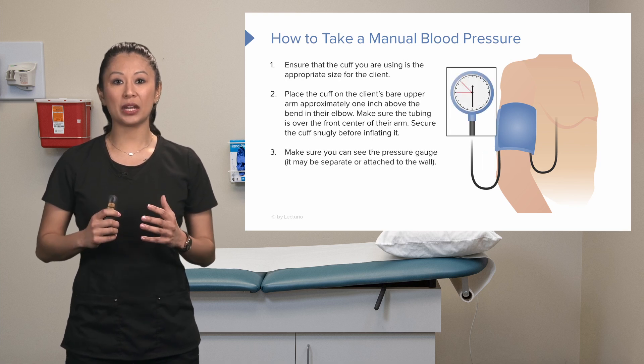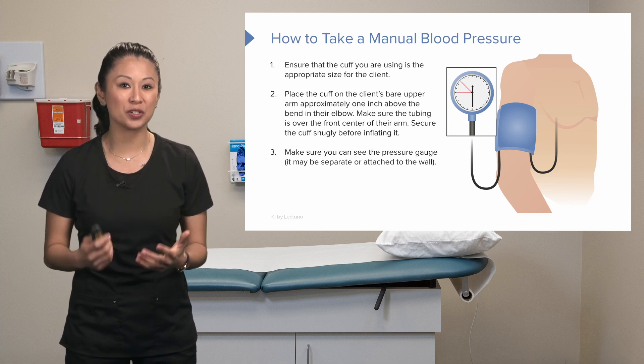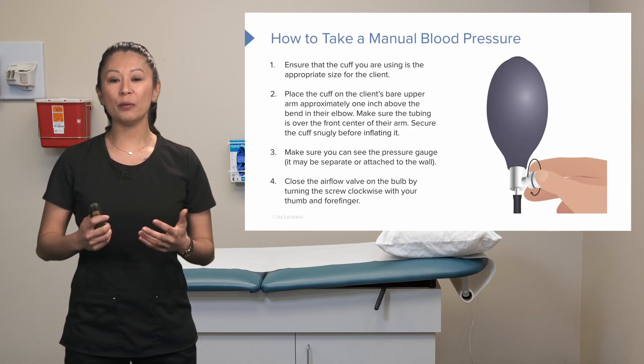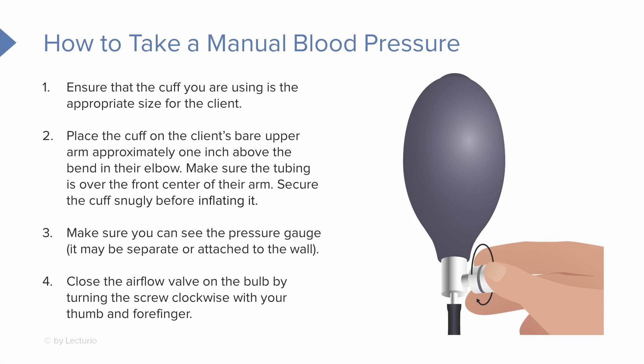When we say snugly, it just needs to lightly hug the arm — not too tight and not too loose. We need to make sure we can see the pressure gauge, because that is where we get our readings. Pick up the bulb, close that airflow valve — you can see the little screw in the image; that's the pressure valve — and turn it clockwise with your thumb and forefinger.